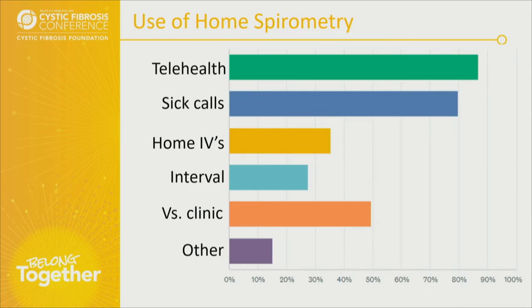And then in the questions, what we meant with interval, and we explained it a little bit further, was where you were using it for a specific purpose, to monitor for FEV1 decline, to just keep technique up so that if you did get sick or had a telehealth appointment, you'd be good and ready to know how to use both the app and the device.